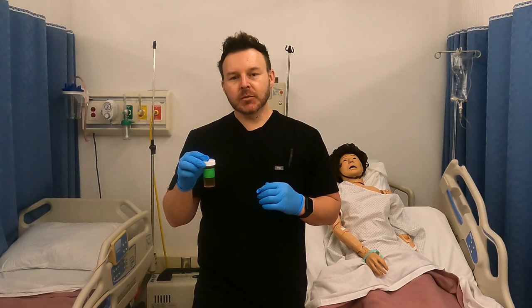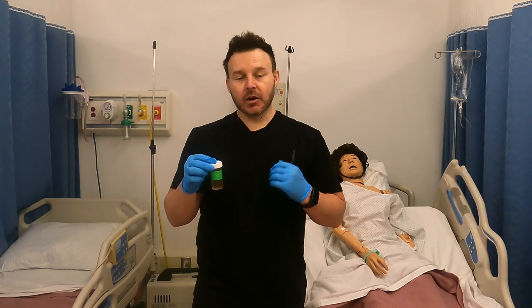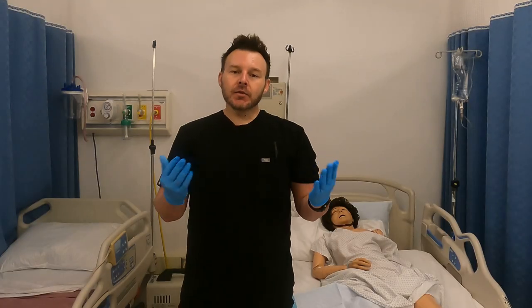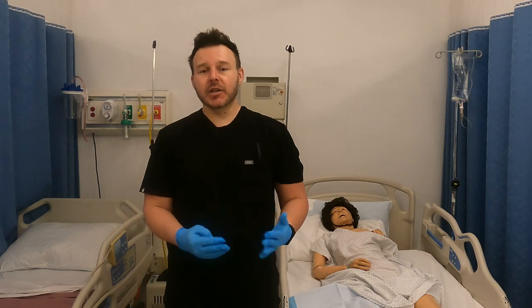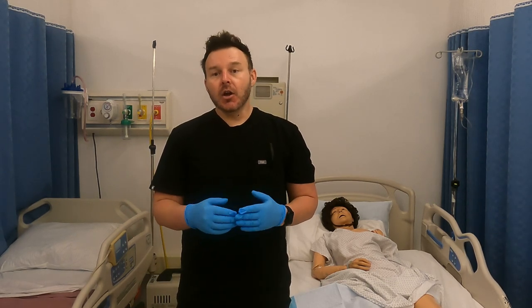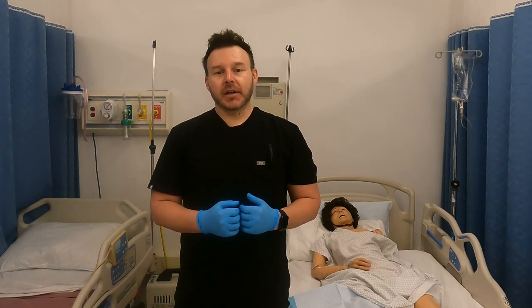Professor Rich Aran here with you today. I'm going to show you how I got this UA, or urinary analysis, from a Foley catheter for my patient Michelle right here. If your physician has ordered you to get a UA sample from your patient who has a Foley catheter already in place, we cannot take it directly from that bag if it's been inserted already. So what we're going to do is use the port that's provided on the Foley catheter kit.